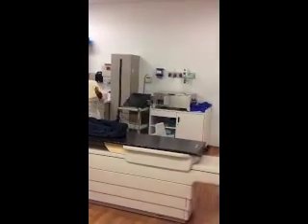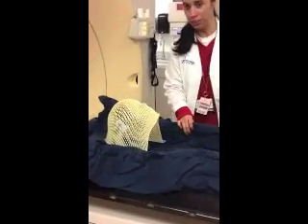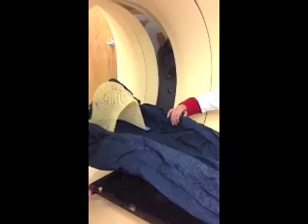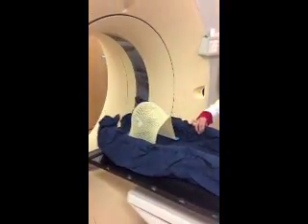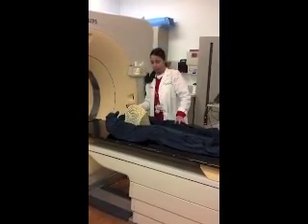We'll position the patient on the table as such, place the mask on the patient, and then the patient will go through the CT scanner in a motion such as this. Once the patient is CT scanned, the physician will then come in and place the isocenter.